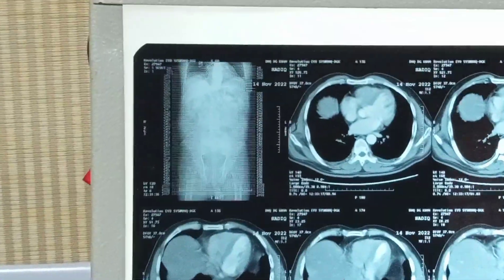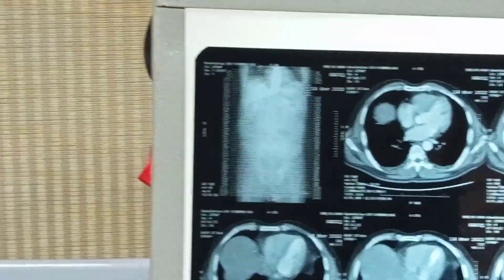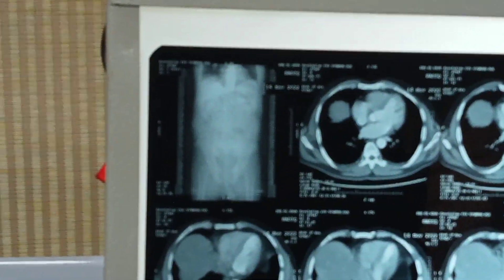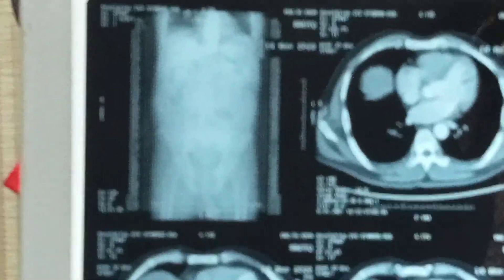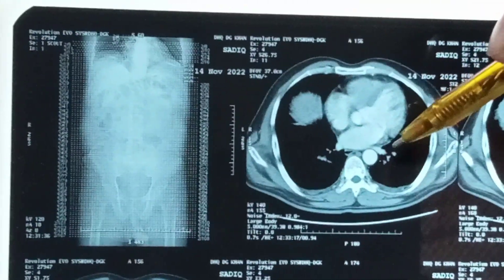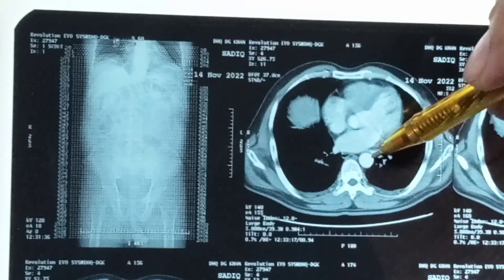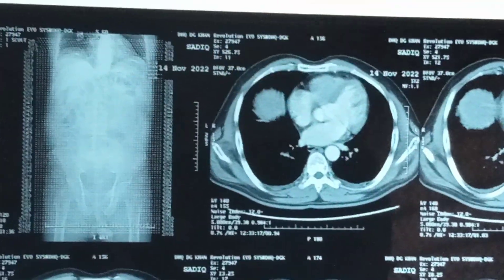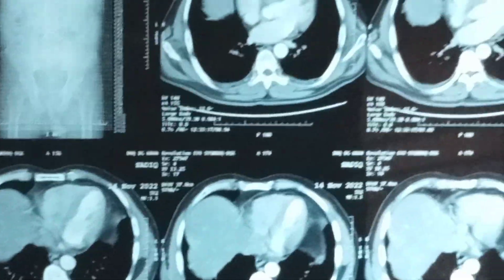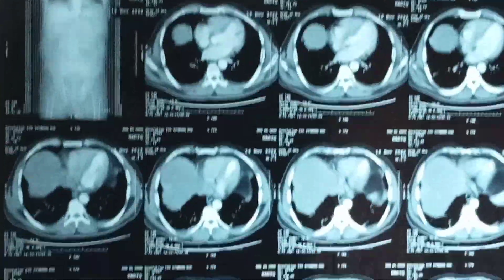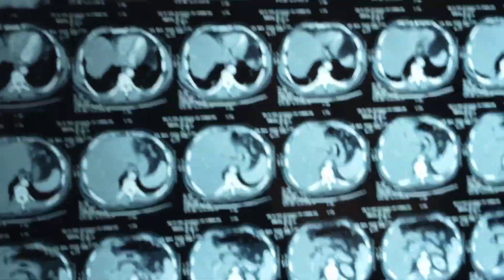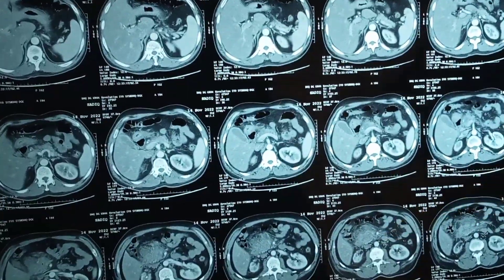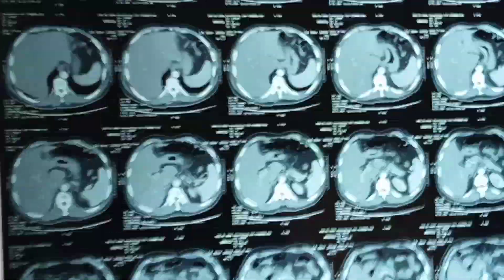Now, one thing you are seeing in all the slides is this dot. You will see that this dot is present in the whole of our slides. Anywhere you focus, you will see this dot. And this dot is basically the aorta — you will see it in all the slides.